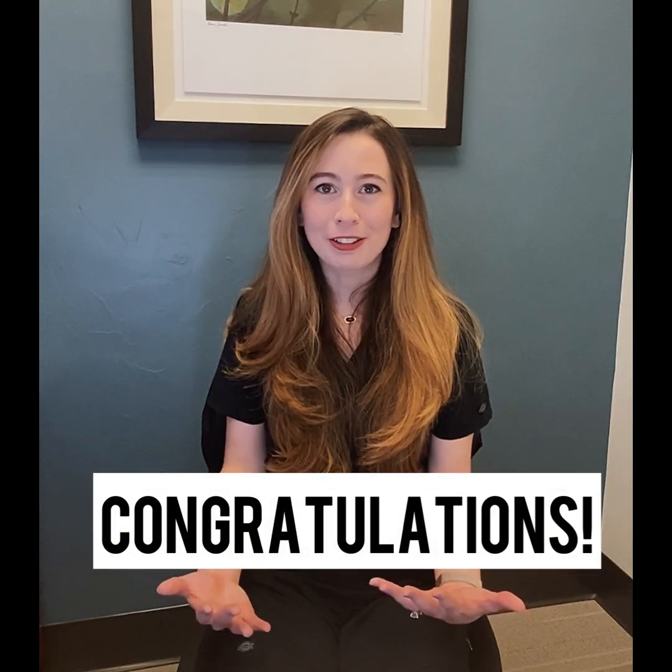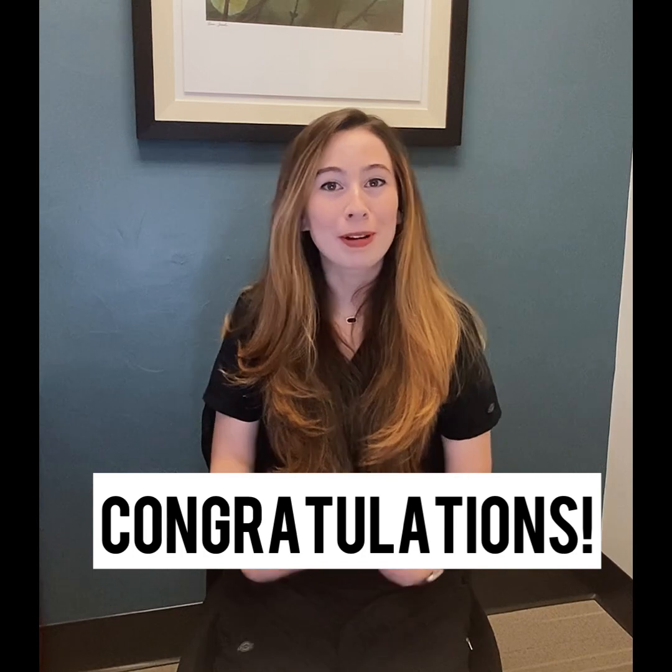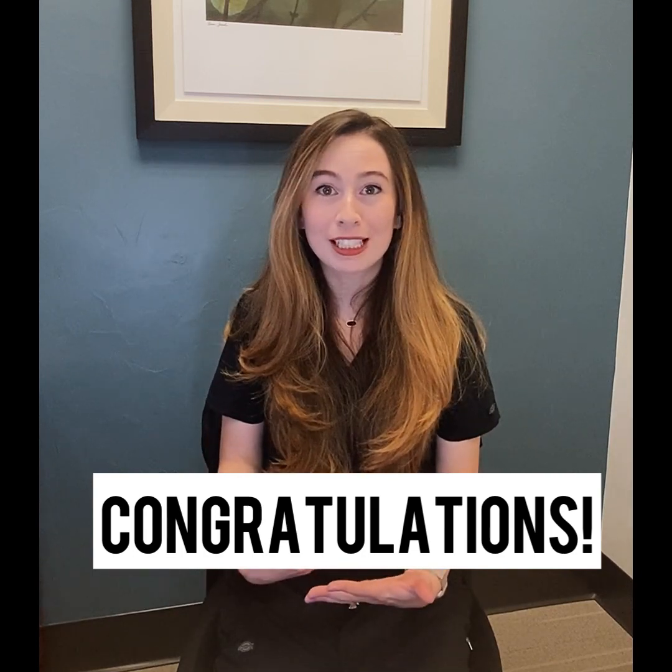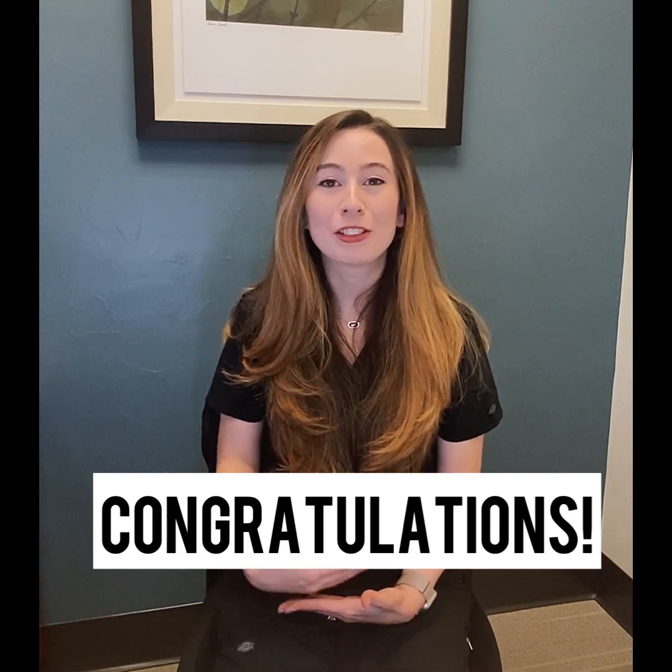Congratulations from everyone here at Huckabee Dental on starting your Invisalign case. My name is Emily, I'm a dental assistant here and I'm going to give you some of my pro tips and tricks to help you have a successful and life-changing Invisalign.